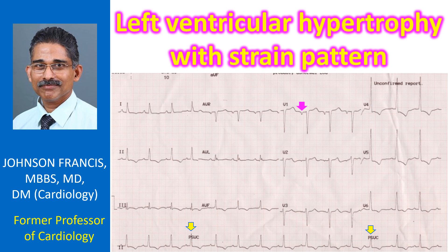They are characterized by their premature nature, a P wave of different morphology preceding the QRS — in this case merging with the T wave of the previous beat — a narrow QRS complex, and an incomplete compensatory pause.